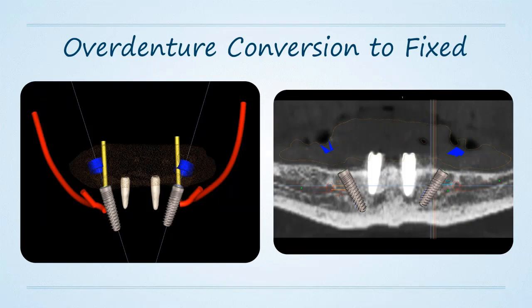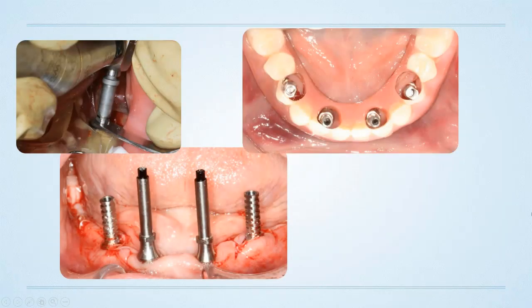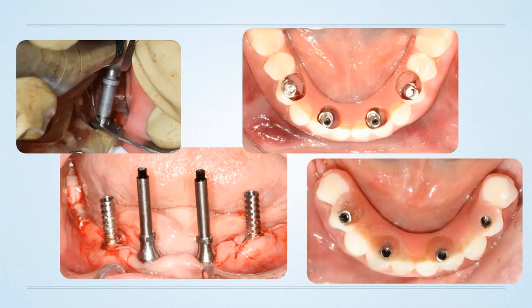And those anterior implants were placed at appropriate positions, not just the canine position, because if they were placed at the canine position, it would be a little bit more to the lateral. Canine 27 is here, 22 is here. This is B and this is D. This would be A and E. And then once we place the 2 additional implants, it's pretty simple to convert that patient over into a fixed restoration.